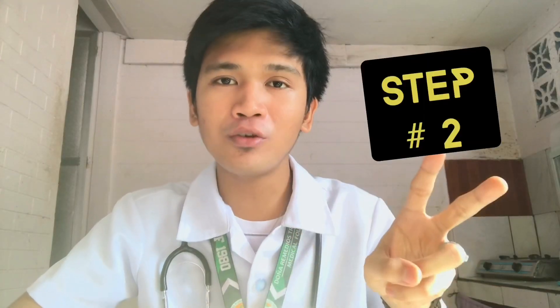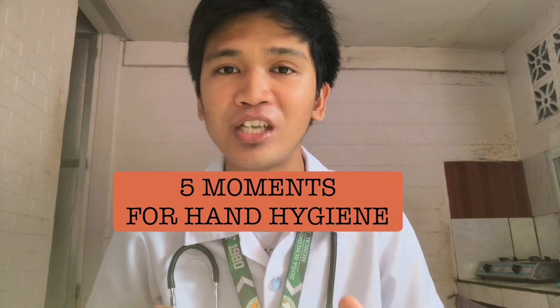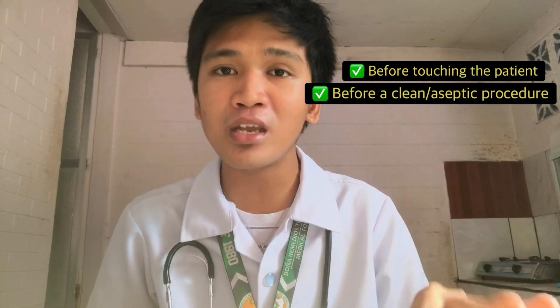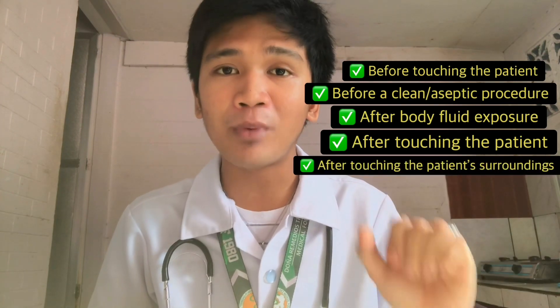Step number two: perform hand hygiene technique with an alcohol-based formulation, or with water and soap. We need to wash our hands because we want to prevent the spread of bacteria or viruses, and we do not want to do any harm to our patient. According to the World Health Organization, we need to follow the five moments for hand hygiene: number one, before touching a patient; number two, before a clean or aseptic procedure; number three, after a body fluid exposure; number four, after touching the patient; and number five, after touching the patient's surroundings.